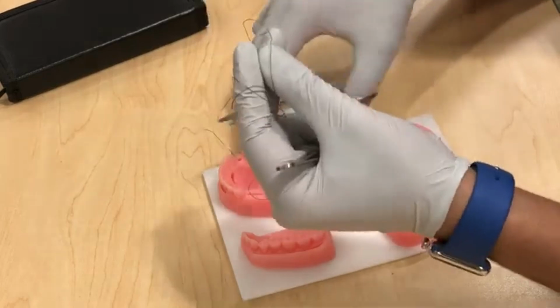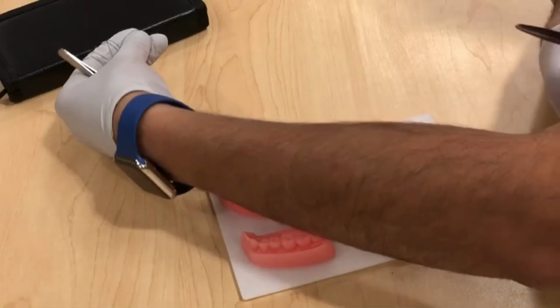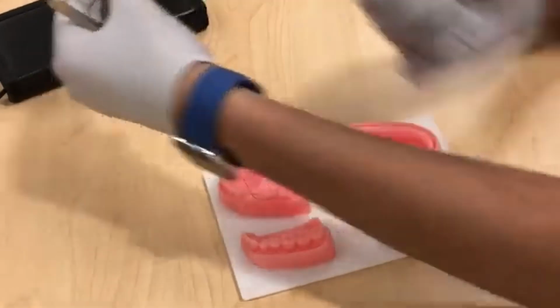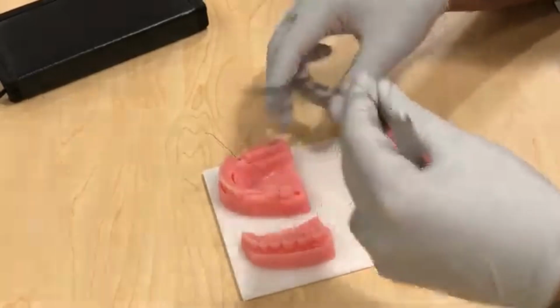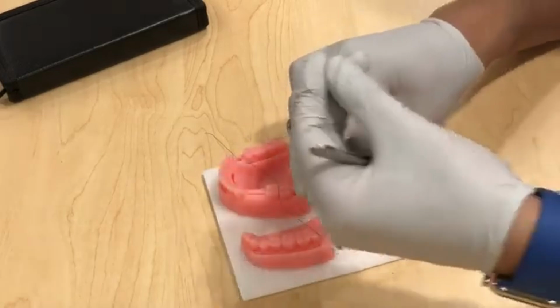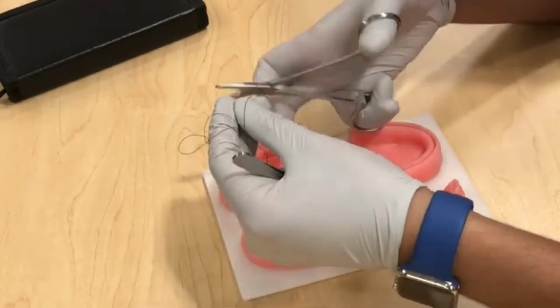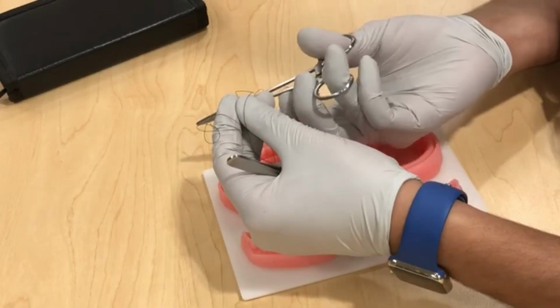Okay, so I'm gonna give you an easy tip. Always do your loops toward the short end, and then tighten the knot on the other side, to the opposite side. Okay, so we're gonna start with a 2 loop. You need to have enough distance, so about 2 palms. Okay, and then you do your first loop, second loop, then open, and you want to grasp the tip of the short tail.